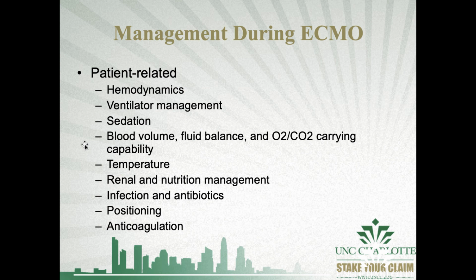With VA ECMO, inotropes are your friend, and so are vasodilators and vasoconstrictors, so antihypertensives. If you're on VA ECMO and you develop hypertension, you're going to have an increased resistance in your output, just as you would with your heart. It functions the same way.